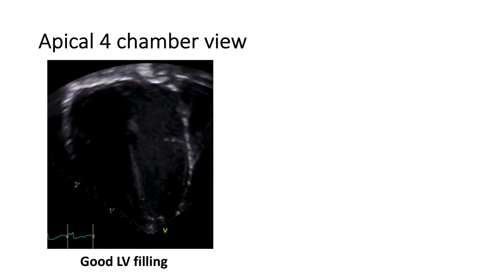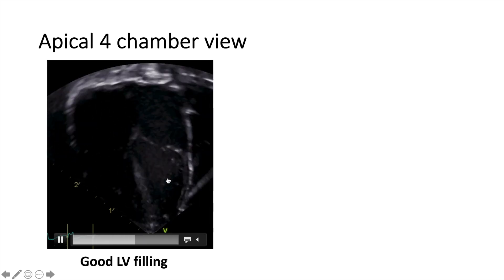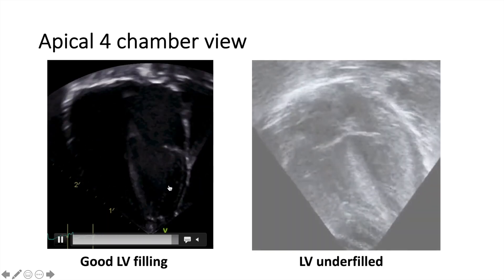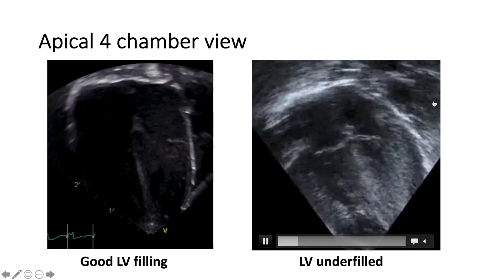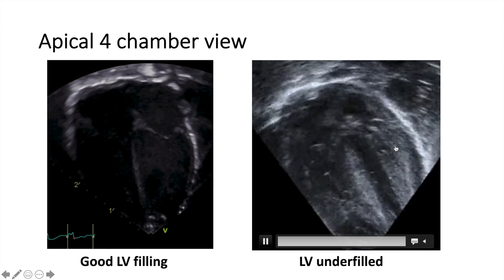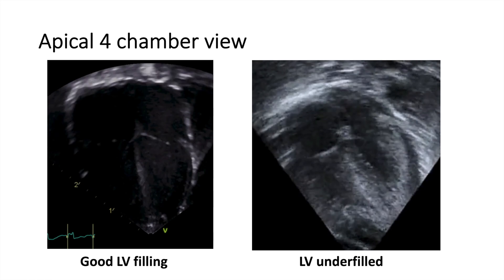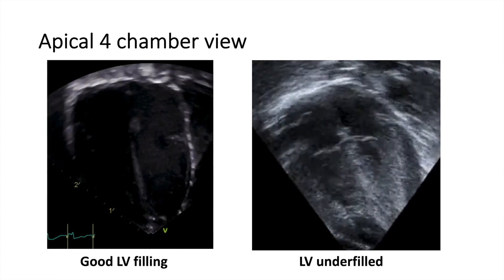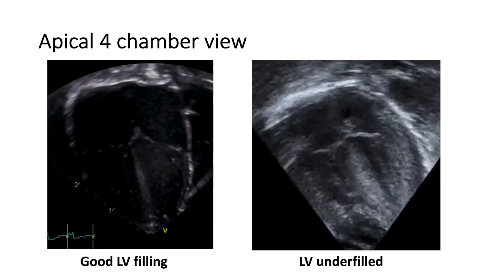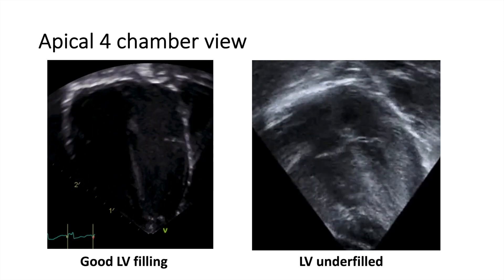What else do we look at? We look at the filling — the LV filling. You can say that the LV is not underfilled here. As opposed to this image, you can see the LV here is almost empty. We use the term that the walls are kissing, and this is because of the underfilled LV. This is suggestive of decreased LV preload. So we talked about the contractility and the filling — this is all from the apical four-chamber view.